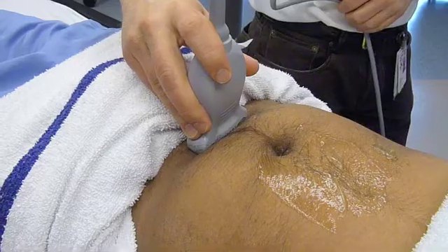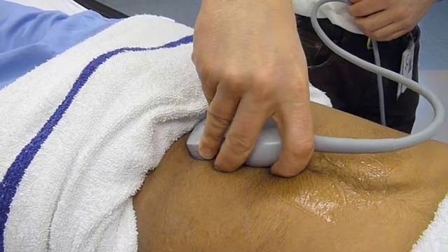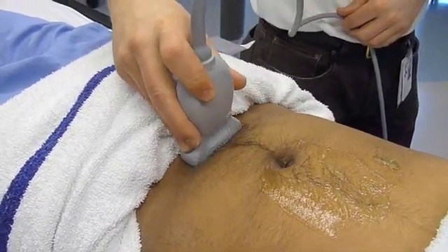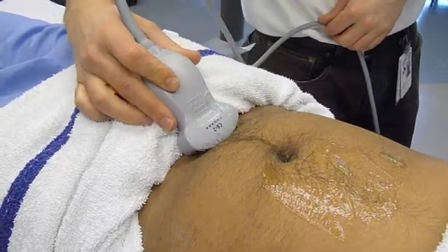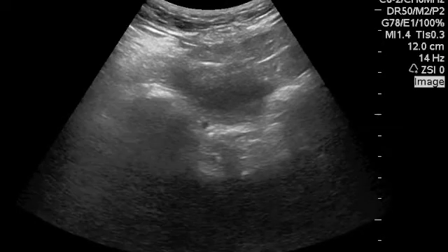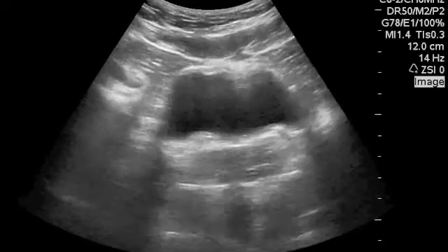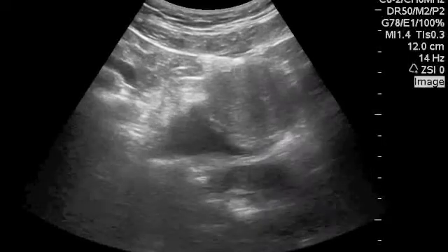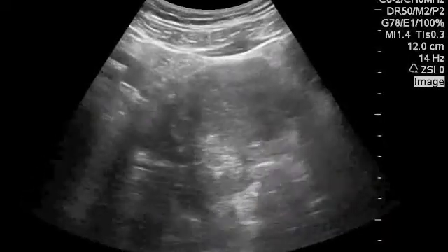Let's look for free fluid in the pelvis. Position the probe about 1 cm above the symphysis and look right down at the patient's feet. Then slowly sweep back until you see the bladder appear and completely disappear. Fluid usually appears behind the bladder or between the uterus and the rectum in the female patient. Here's the uterus coming into view and disappearing.